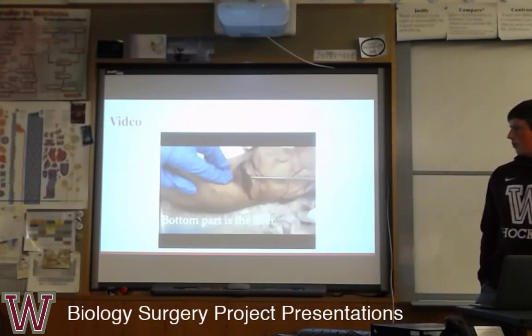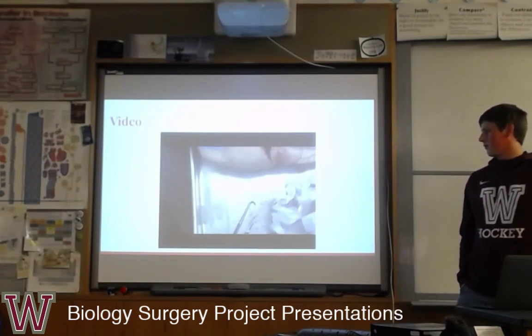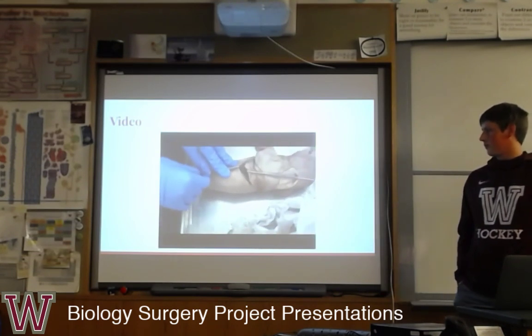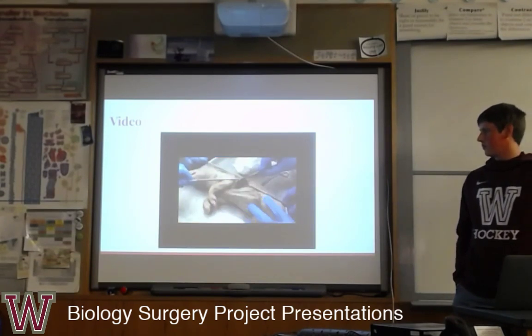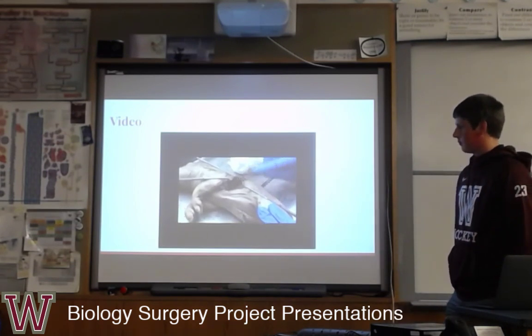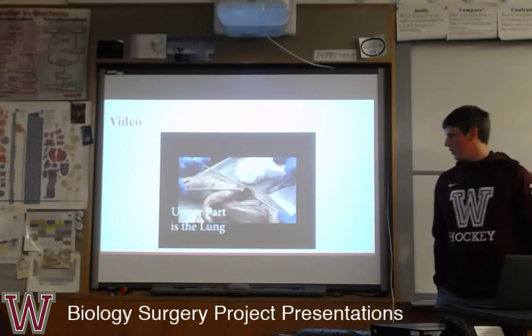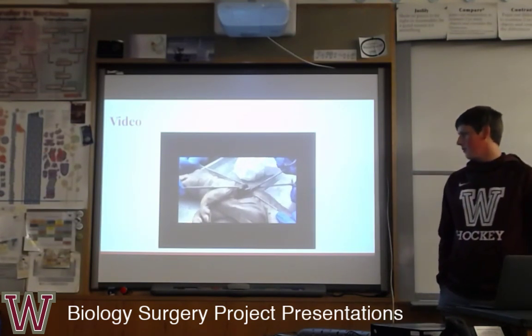Next, we had to pull the skin back to expose the lung so that we could perform our procedure. This right here is us cutting off the lobe and then removing it from our patient.